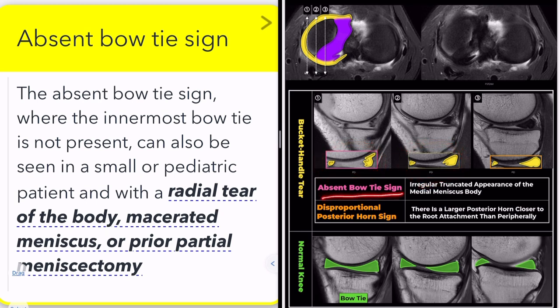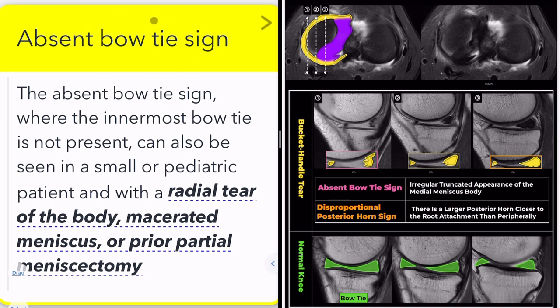This can include a bucket-handle tear with displacement, a flap tear with displacement, prior resection of a meniscal tear, or degenerative maceration of the meniscus's inner edge, resulting in the absence of the normal bow-tie appearance.